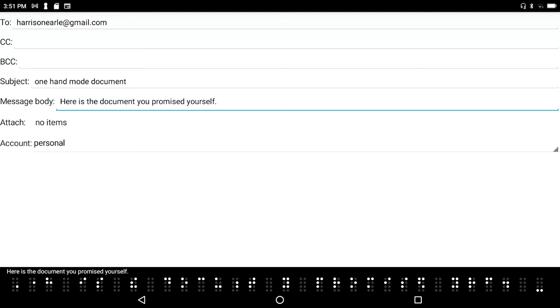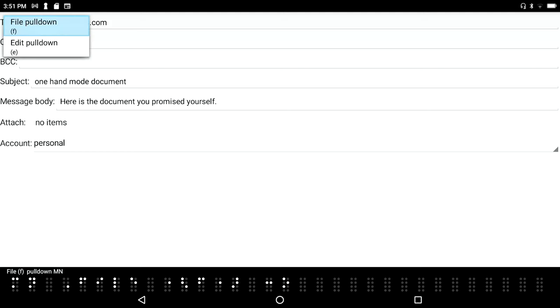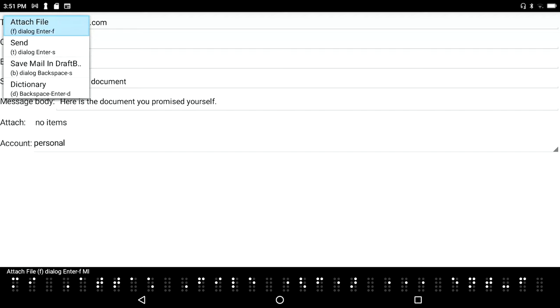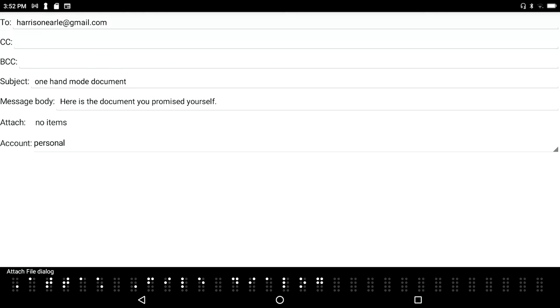Now I'm going to press F2 because that's the key that gets into the menu system for the application I'm in, which is the email client. I'll press enter - it's on the file pull down menu, and the very first option is to attach a file, so I'll go ahead and do that.